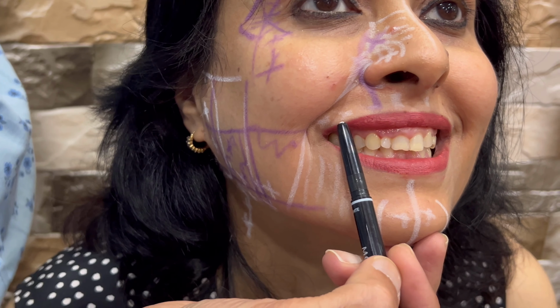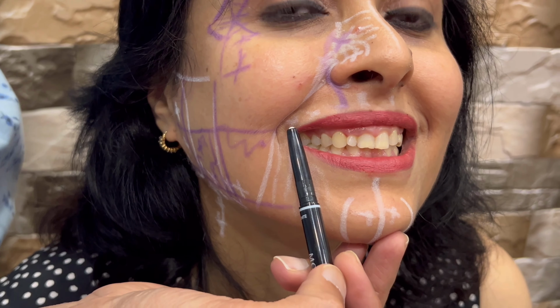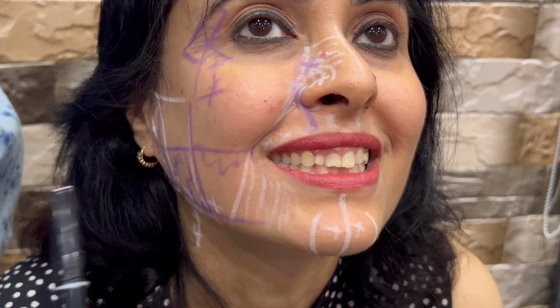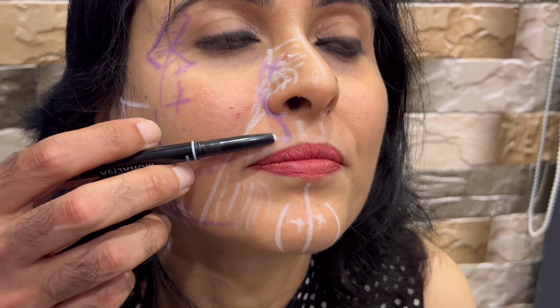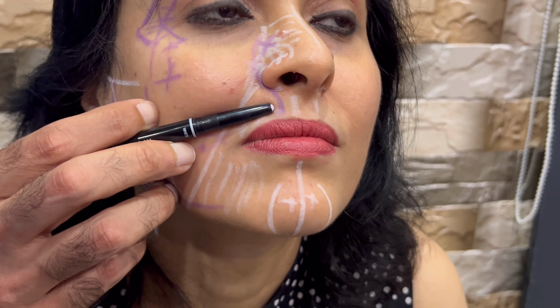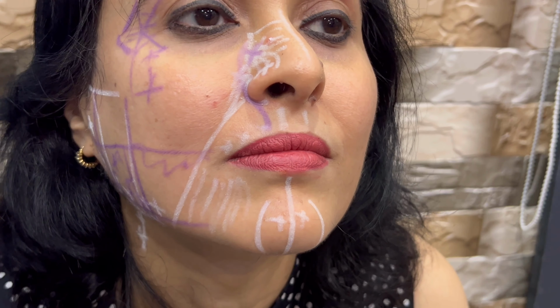Here what you're trying to do is the in-rolling that is happening with the lip. So that lip is becoming thinner when she's smiling. So if you want to give her a lip volume, relax, you are going to turn this lip out like that. Okay, and then you can put a little bit of filler in the lip to give her a lip volume.